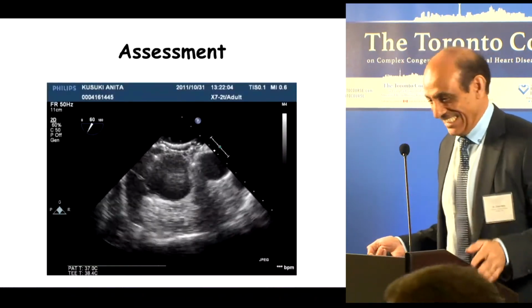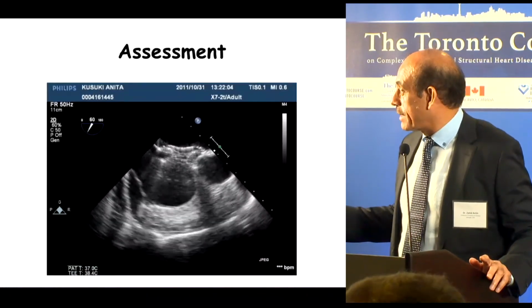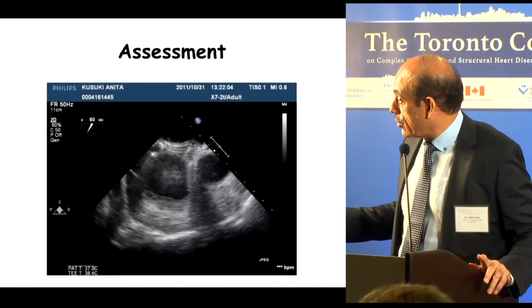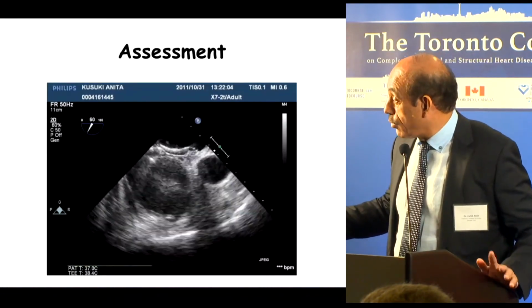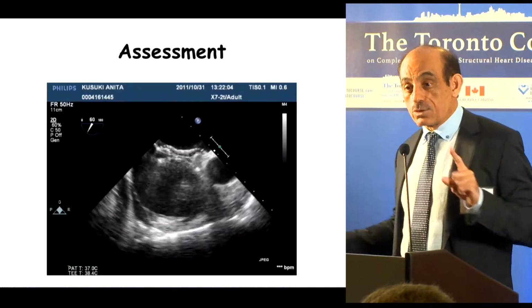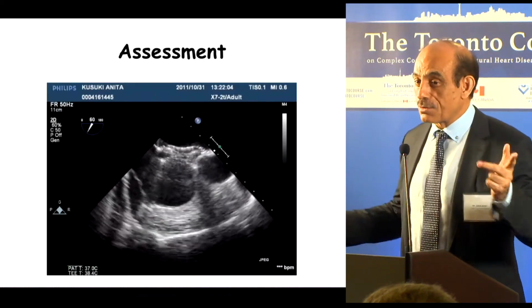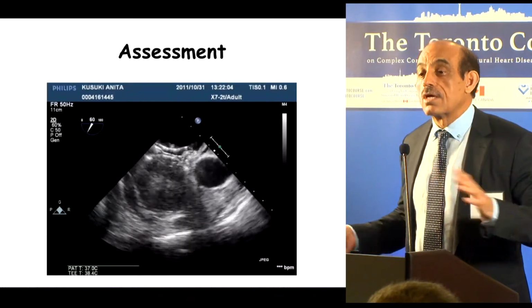Okay. And here is a picture of a patient where the right atrial disc actually has gone into... See, this is the transverse aorta, transverse sinus. This patient is asymptomatic, by the way. The right atrial disc is already in the transverse sinus, so the erosion has already occurred here. But the reason patient is asymptomatic is because it hasn't gone to the aorta, so there is no tamponade. So the small amount of bleeding that occurred caused small amount of effusion and nothing else.